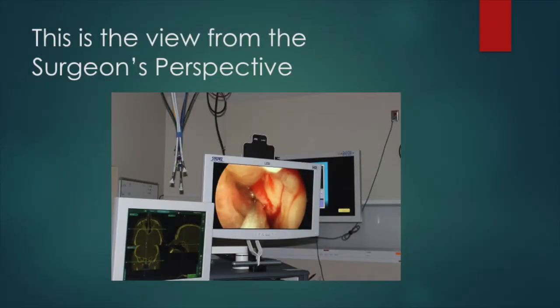This is the view you get from the surgeon's point of view. And I had some pictures taken while I was operating by one of the representatives that managed this for us. And so you're looking at this from the same view I have, except I also have a patient view in front of me. That's the surgery happening on the television screen that I use the endoscope to see. It's magnified, much larger than I could see if I was looking through the endoscope with my eye.